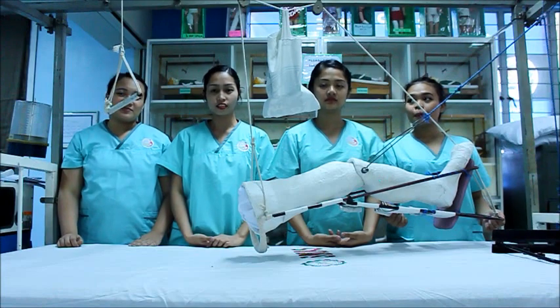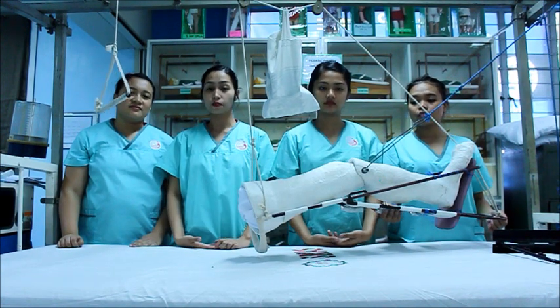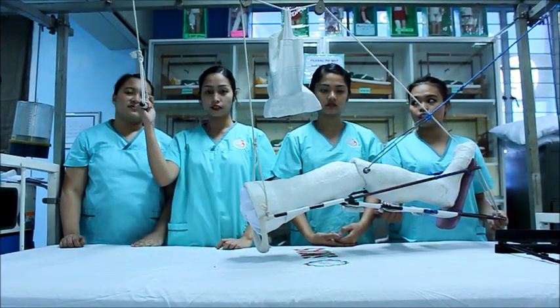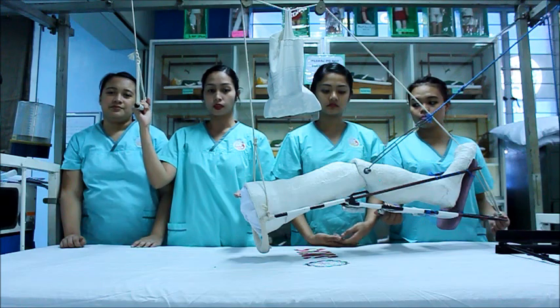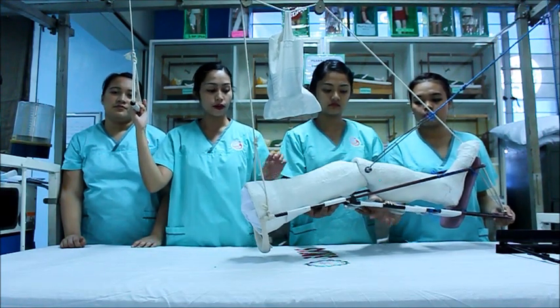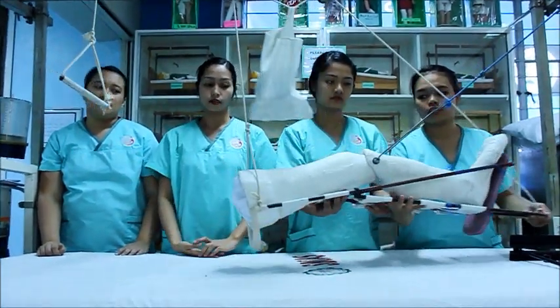To check for the efficiency of the traction, instruct the patient to hold on to the overhead trapeze, slightly lift the buttocks, and then swing from backwards, forwards, and sideways.